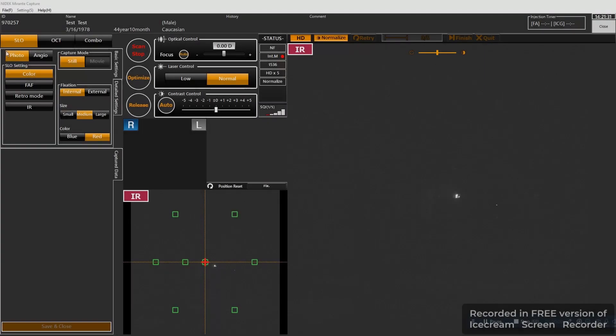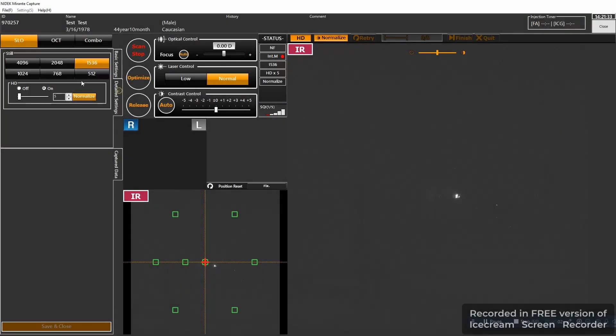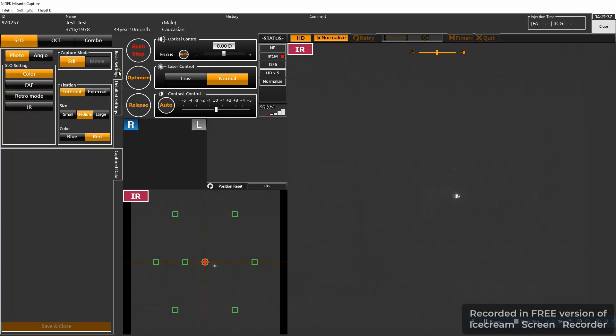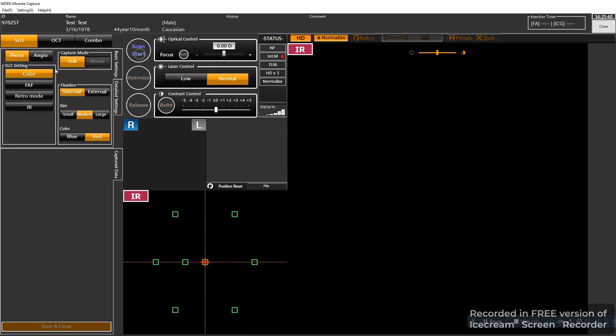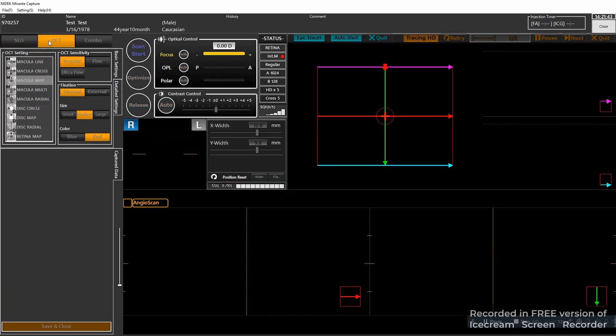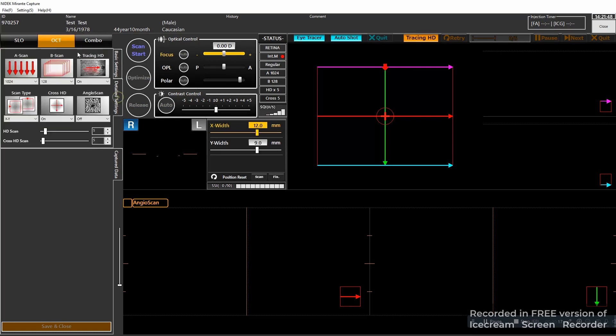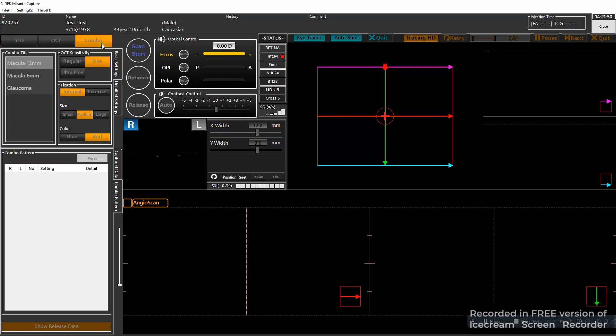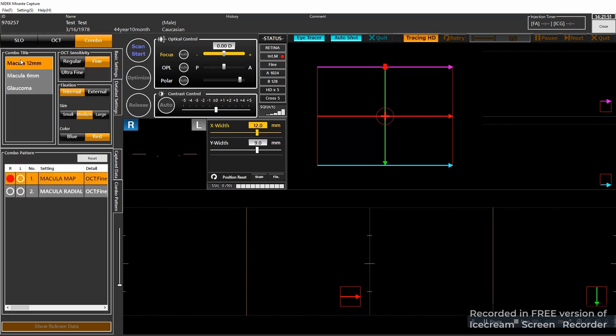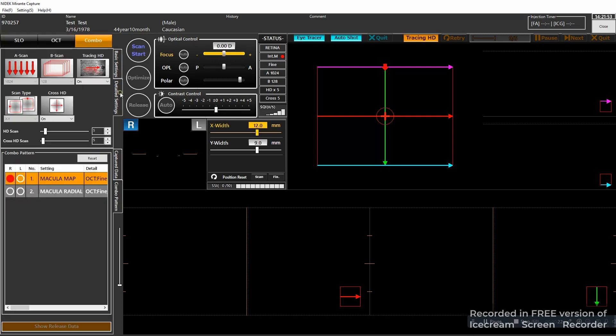This is the capture mode. In capture mode you can change between the SLO and OCT and combo. If you click detail settings you can change resolution. Then you have the OCT mode and here again you have conveniently located fine, ultra-fine or regular which are just the regular scans or you can click detail setting and change the B scans and A scans.